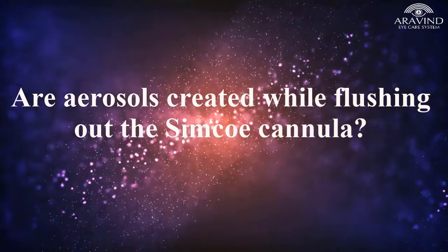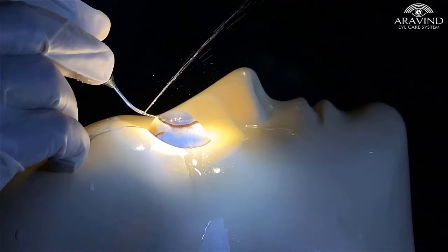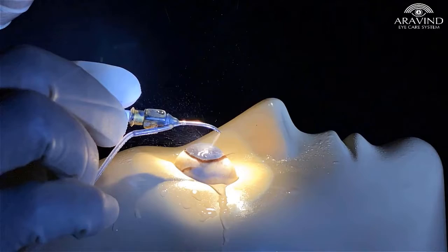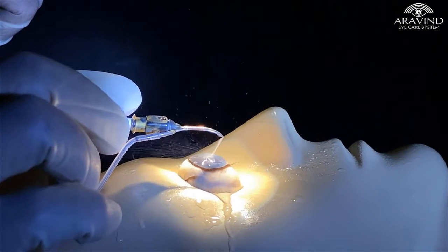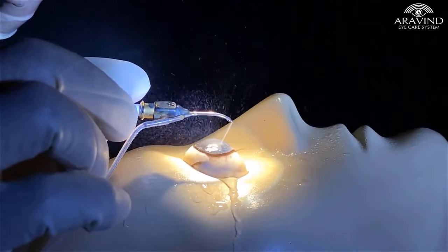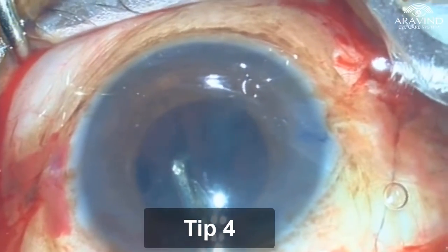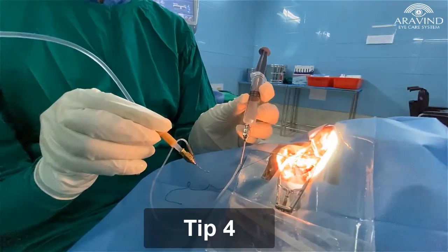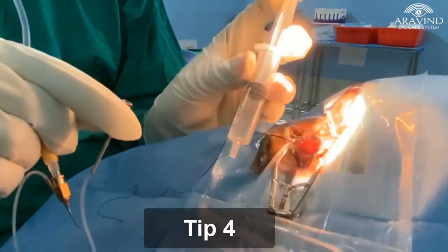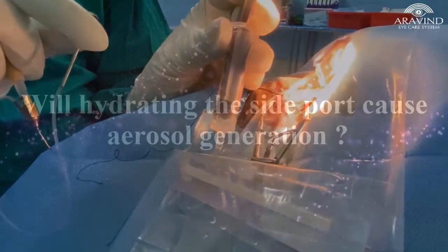Are aerosols created while flushing out the Simcoe cannula? The video clearly demonstrates aerosolization while flushing out the fluid through a Simcoe cannula. If we try to empty the aspirated content by flushing, it generates significant aerosol on touching any surface. If cortex blocks the Simcoe cannula, we should flush it inside the anterior chamber only. Once the syringe gets filled, we should detach the cannula and gently flush out the aspirated fluid directly from the syringe into the drainage bag.